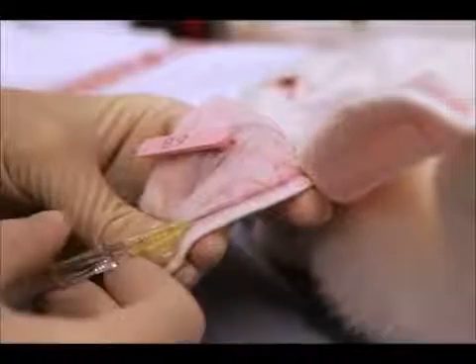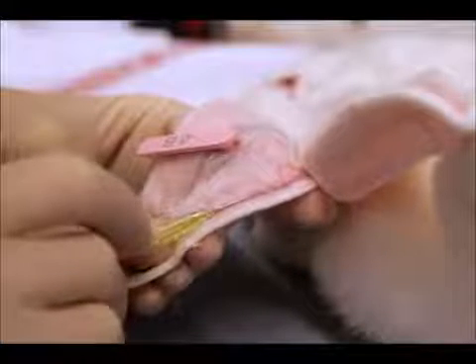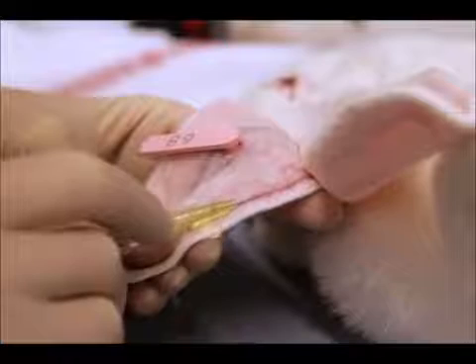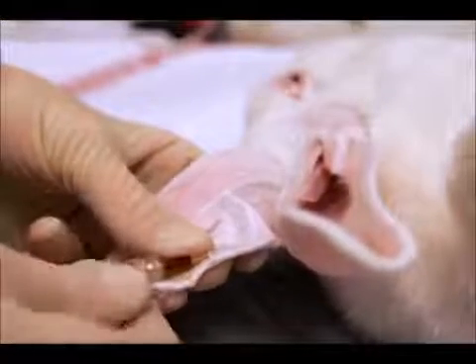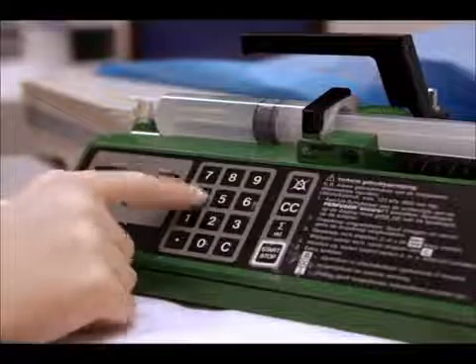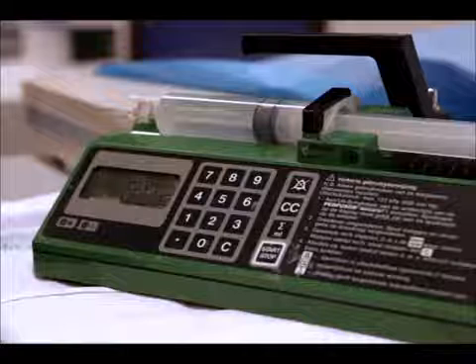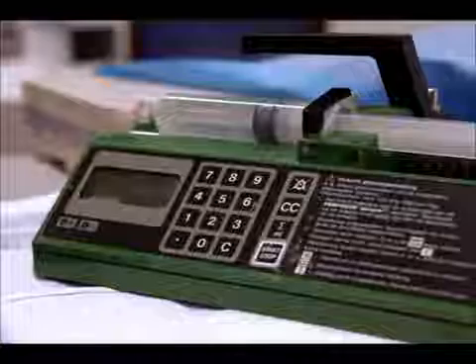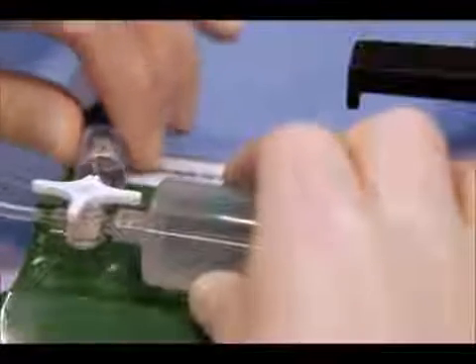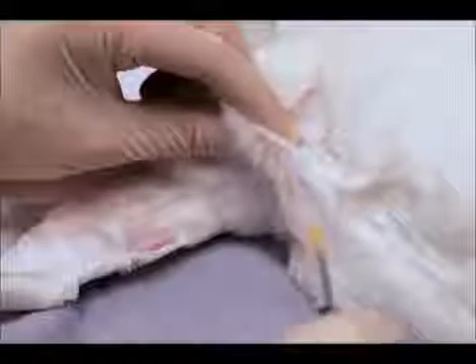After anesthetizing the rabbit, as demonstrated earlier in the video, insert a 24-gauge cannula into a peripheral auricular vein to obtain intravenous access. Maintain anesthesia with a continuous infusion of ketamine and xylazine in normal saline via a syringe pump at 40 milliliters per hour. Secure a 3-way tap and attach a 5 milliliter syringe of rescue anesthesia and deliver a subcutaneous injection of buprenorphine.